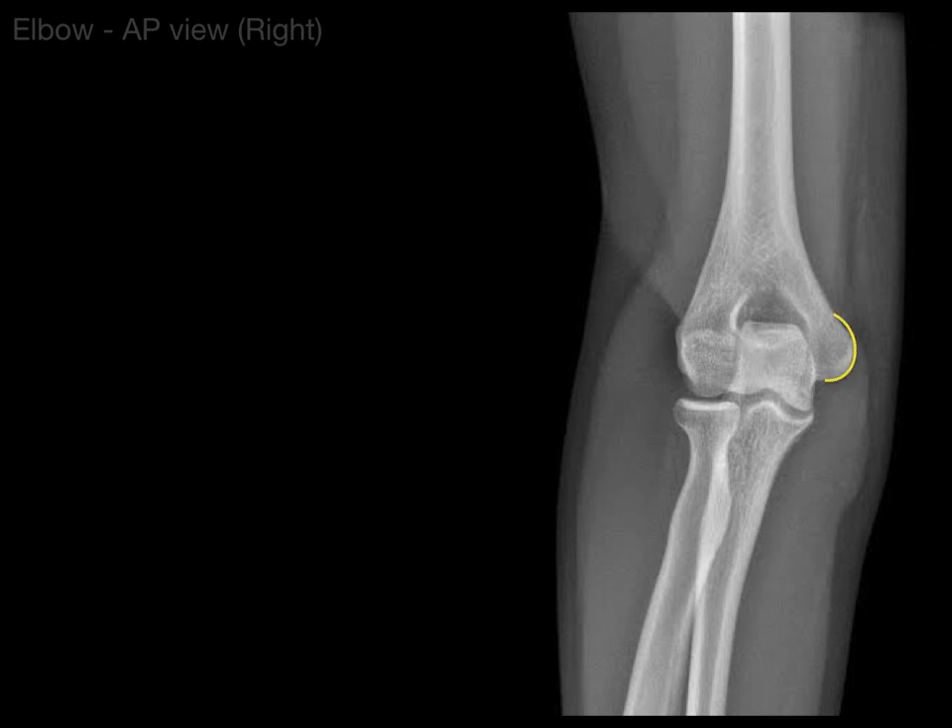First, you can see the medial epicondyle of the humerus, where forearm flexors attach and the ulnar nerve courses underneath it. Next, we have the lateral epicondyle of the humerus, where the forearm extensors attach. Then there is the olecranon fossa — the big fossa on the back distal end of the humerus — where the olecranon process goes in. That fossa is filled with the posterior fat pad.